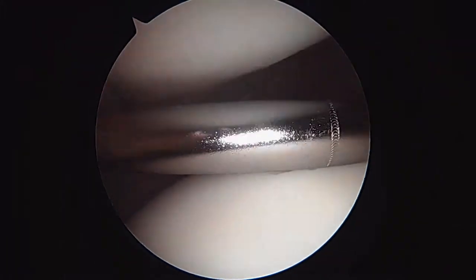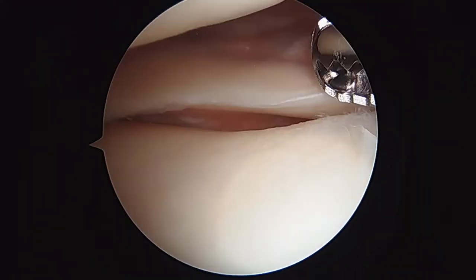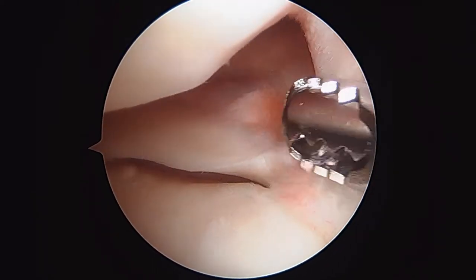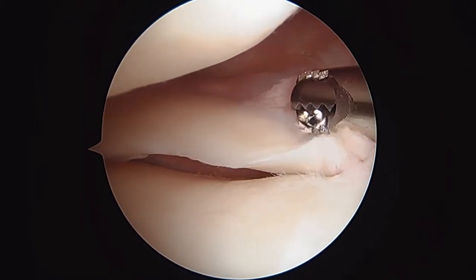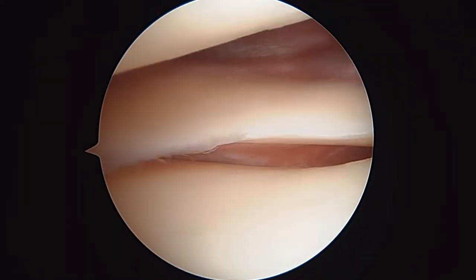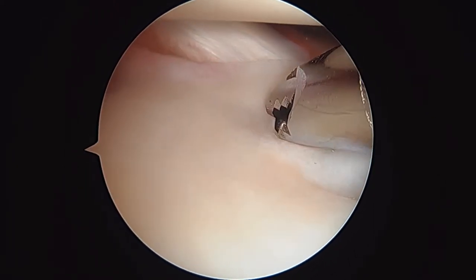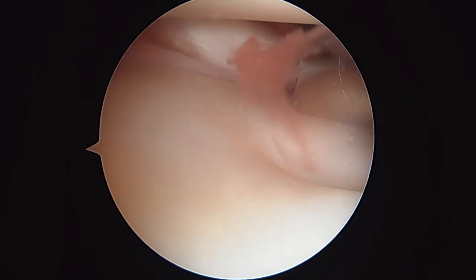Now we're finally going to look in the lateral compartment. We're getting a really good look inside the lateral compartment, where we had some concerns on the imaging and based on your symptoms. The posterior horn is intact, the root is intact, no signs of any significant tearing here. There's the popliteus tendon running up towards 11 o'clock on the screen — that's normal. I'm touching it right there, normal.